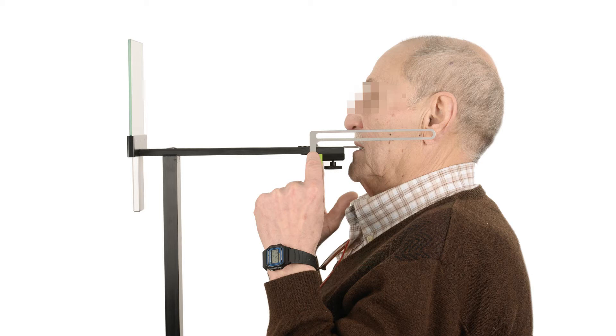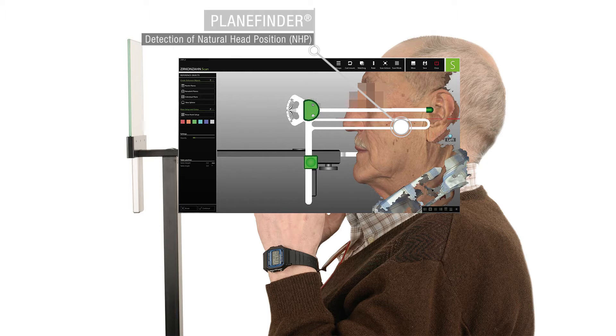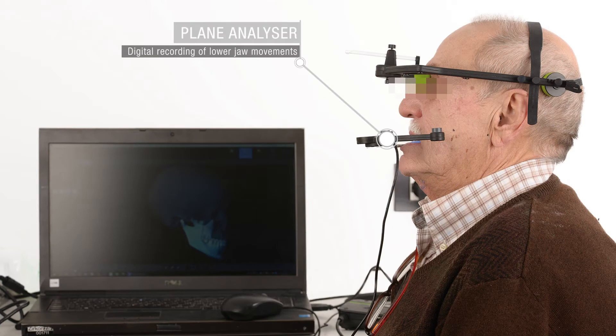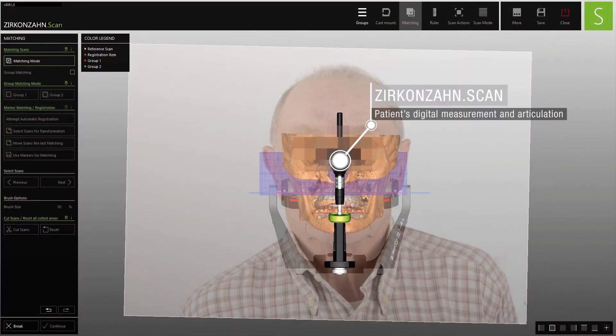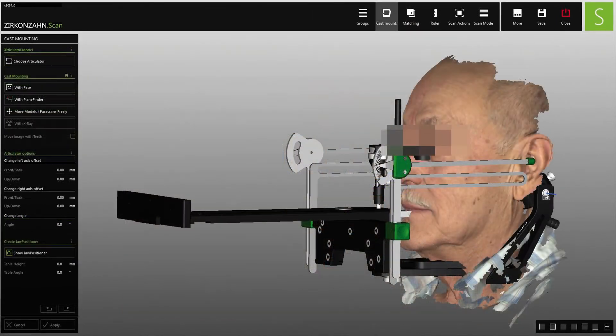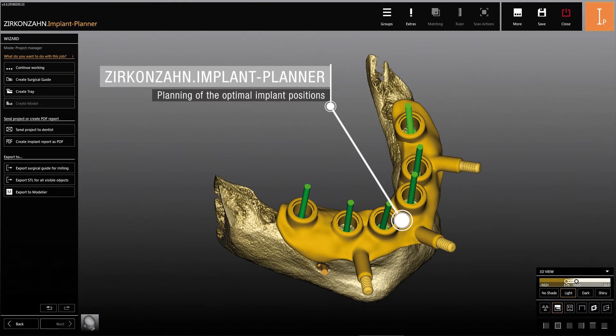An edentulous patient wearing conventional removable prosthesis presented to the dental practice requesting a fixed, high-quality restoration. The natural head position and jaw movements were detected using the plane system and plane analyzer, then transferred to the Sircon's scan software together with 3D facial scans taken from the FaceHunter. Based on all digitally assembled data and taking bone structure into account, the optimal implant positions were determined and planned in the Sircon's implant planner software.